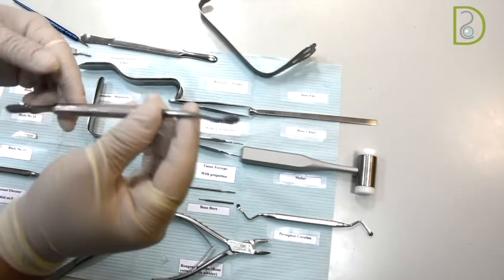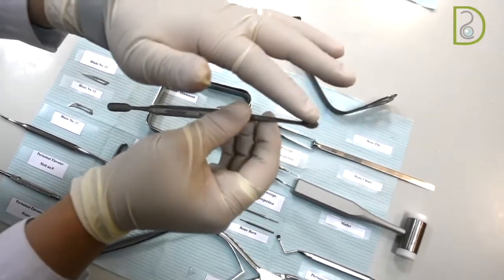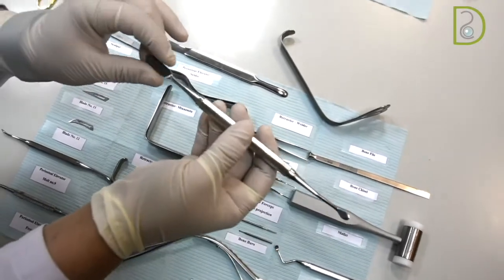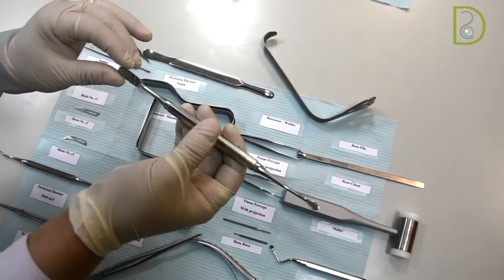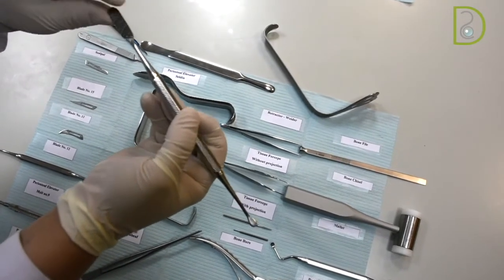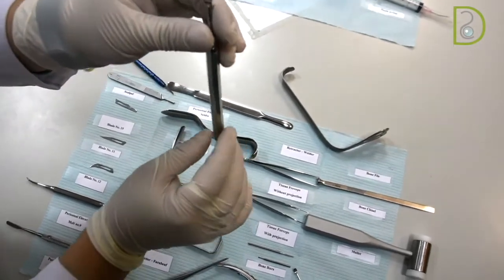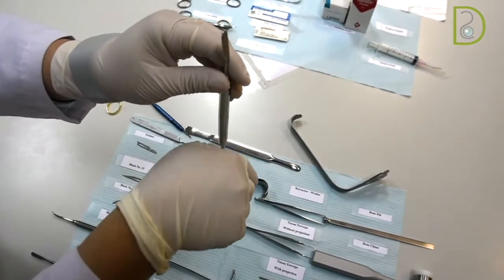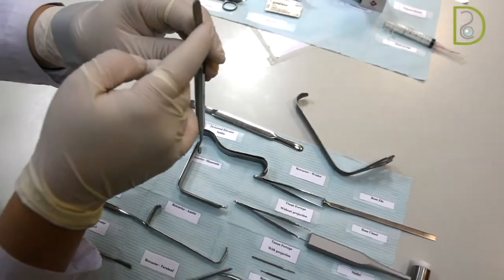The bone file. Looking at the bone file, it has two heads. One is smaller and more rounded. This one is flat and longer. It depends. Sometimes some designs have different shapes, but all of them have this cross-hatched surface. And if you look at it from an angle, you will see that the teeth are all in one direction. And here they are at a 45 degree angle.